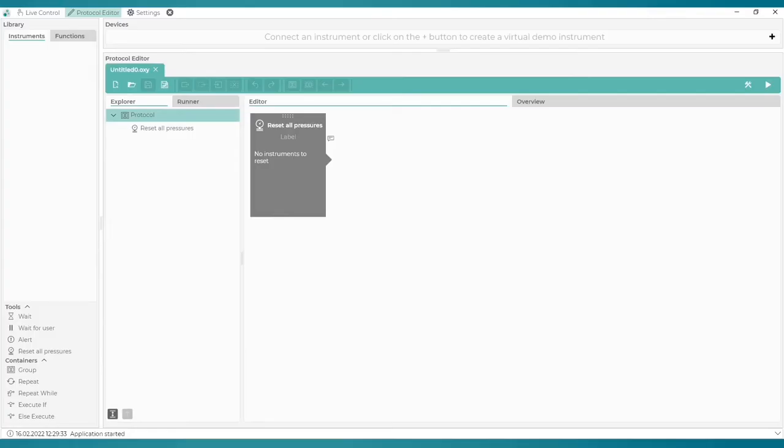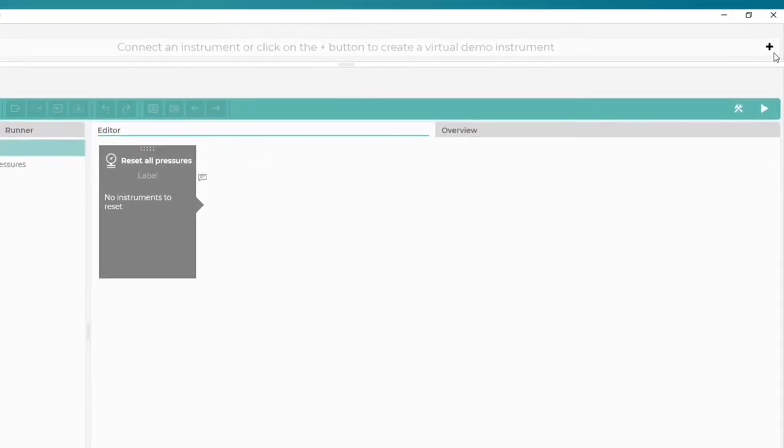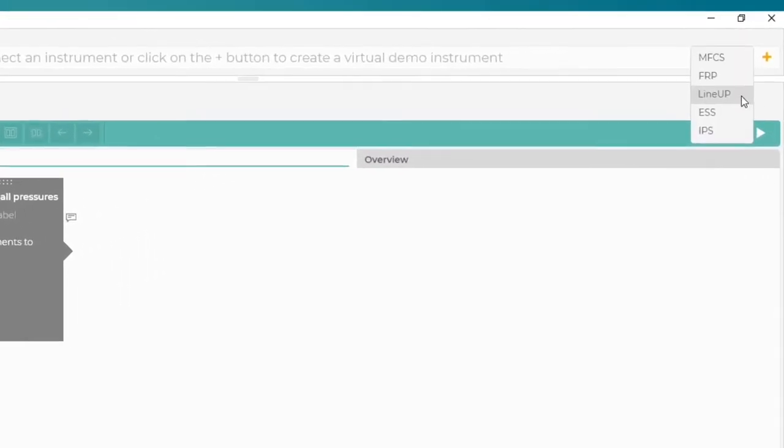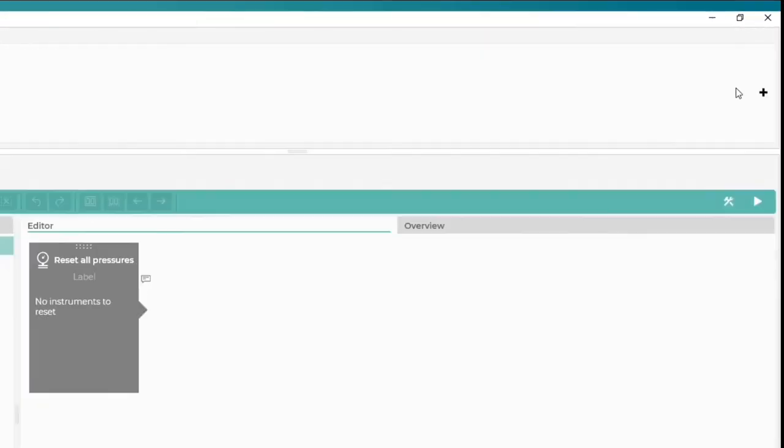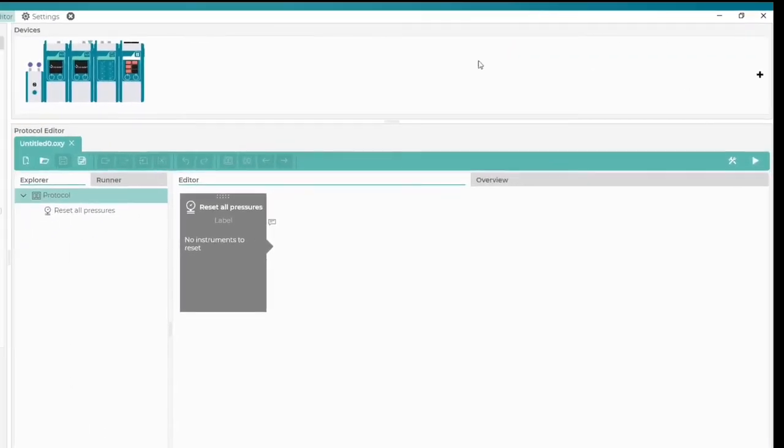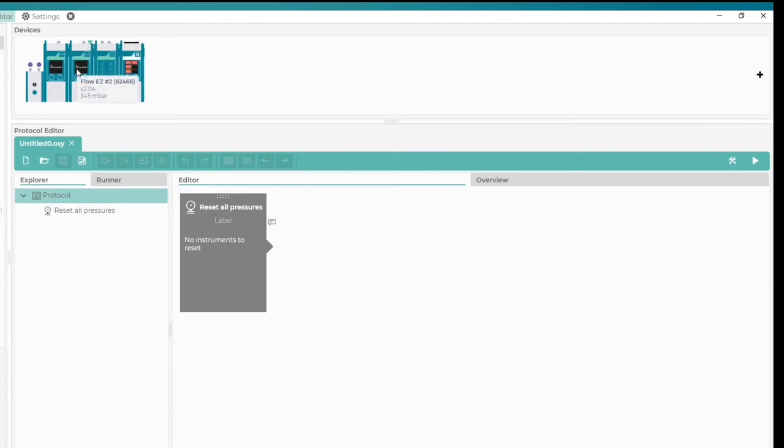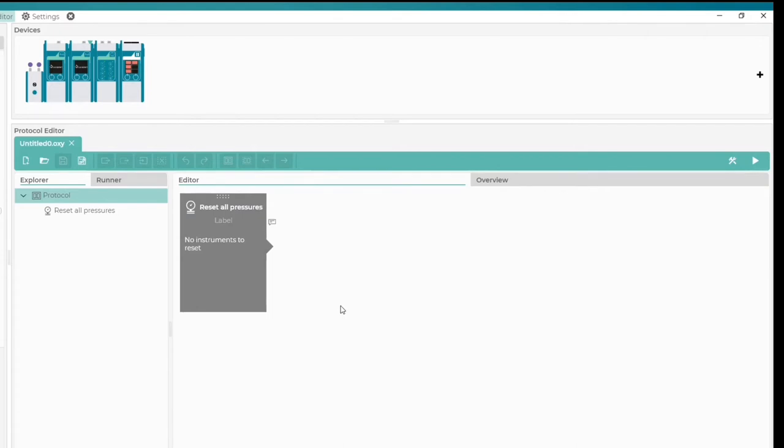Okay let's create this protocol. We will use lineup simulation. We see here that the flow unit is connected to the FlowEasy number 2. By default our protocol begins with the block Reset all pressures. We will just go ahead and leave it there.